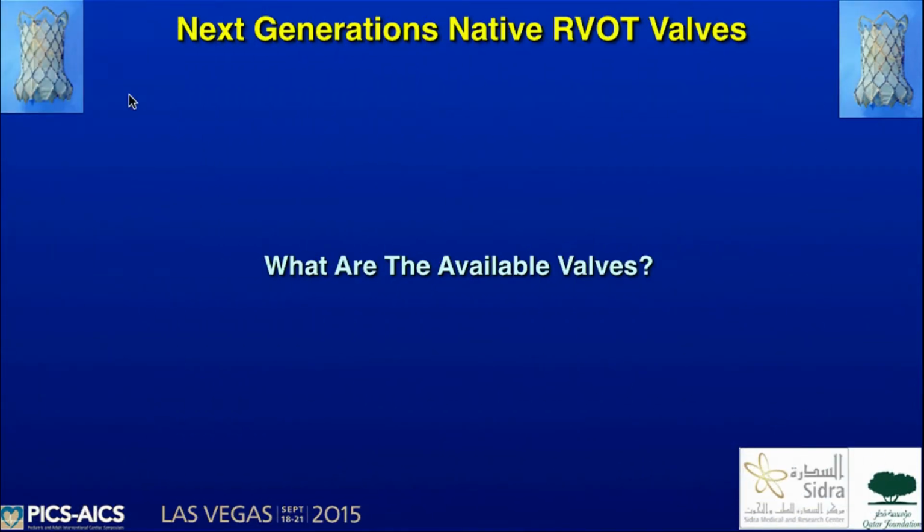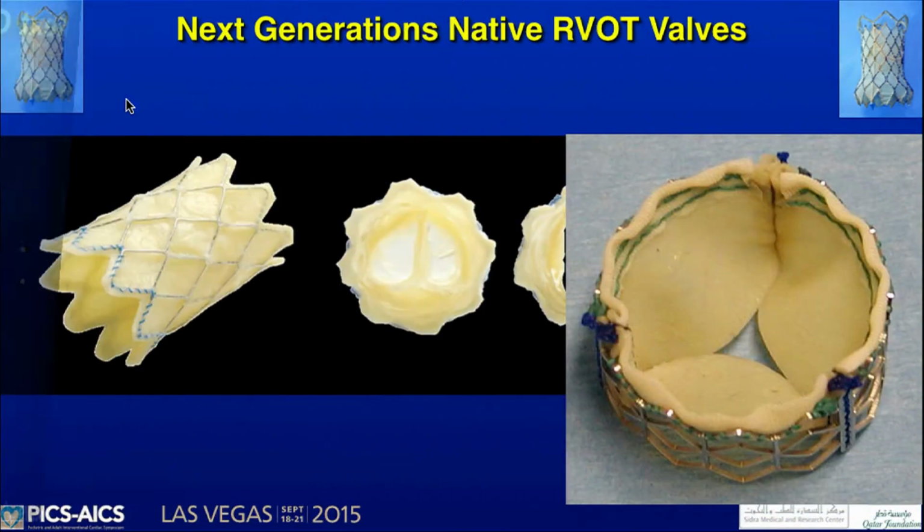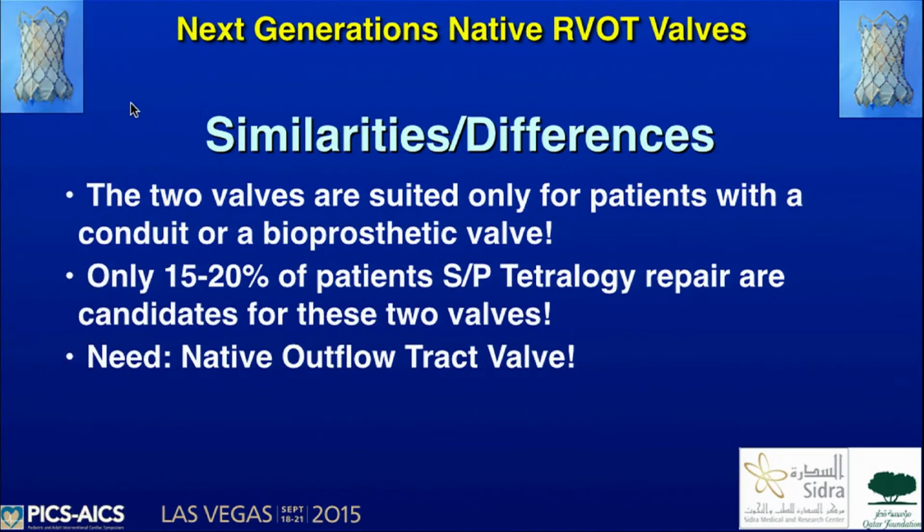So the valves that are available now to us, you are all aware of them, primarily the Melody valve and the Edwards valve. You heard through the course a lot about these two valves, so I'm not going to discuss them at all. There are some similarities and differences between them though.